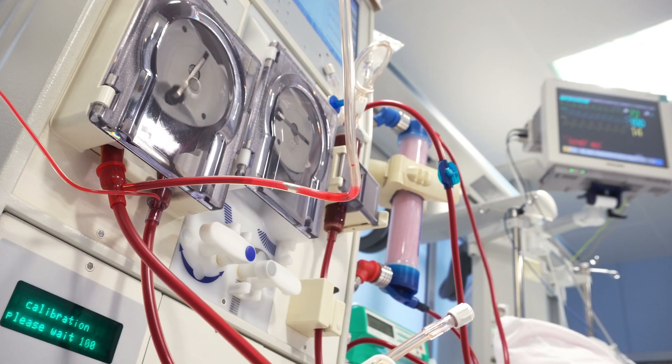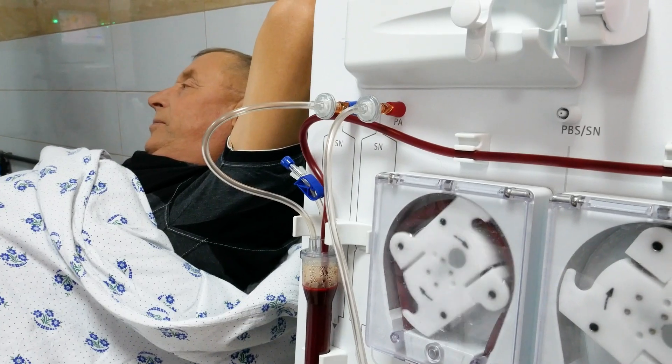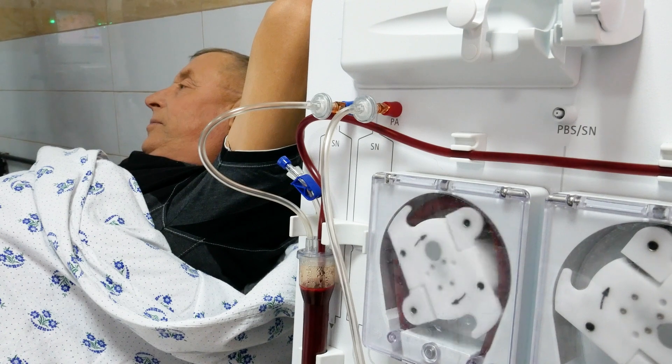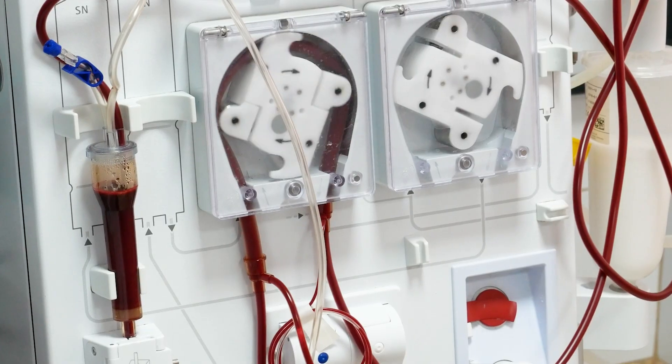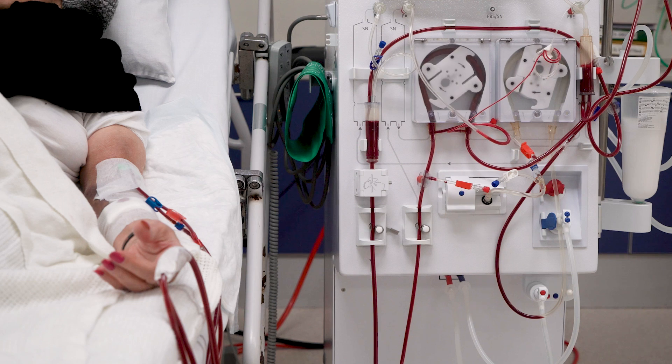Water safety and testing is of the utmost importance when it comes to the health and care of hemodialysis patients. They can be exposed to 300 to 600 liters of water per week, putting them at a high risk of exposure to waterborne pathogens. Timely and thorough testing of all dialysis machines is essential for patient protection.